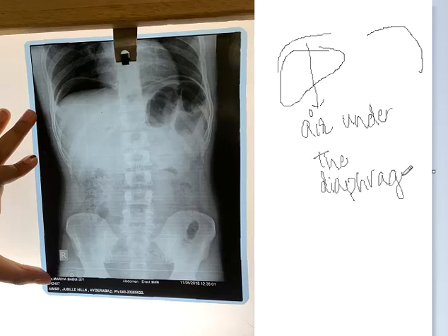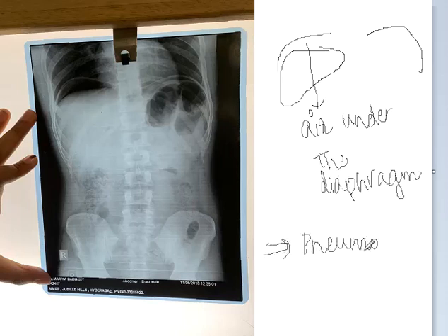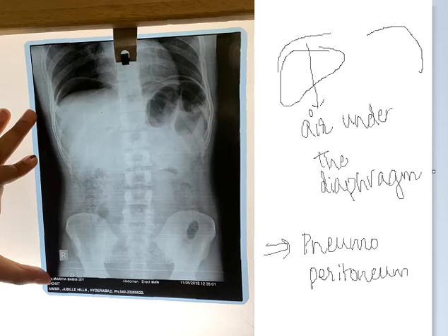And it is called as pneumoperitoneum. So here, there is air under the diaphragm. It is a plain x-ray showing collection of free air under the right dome of diaphragm.